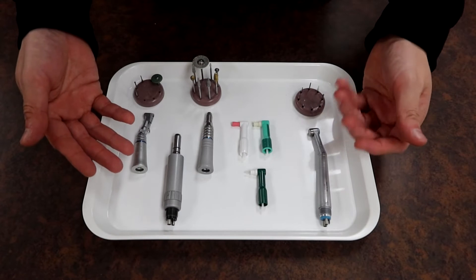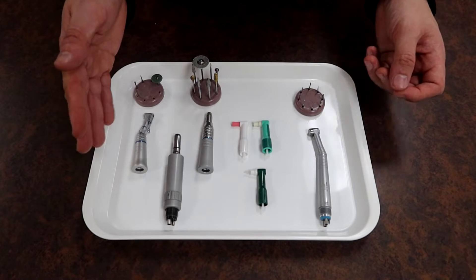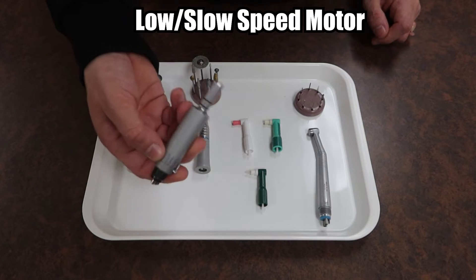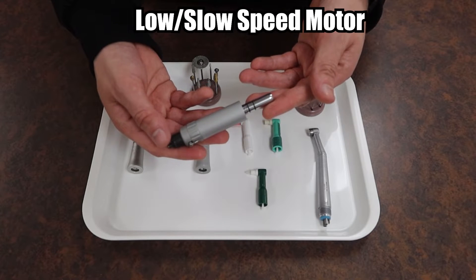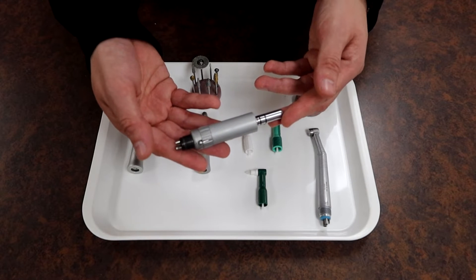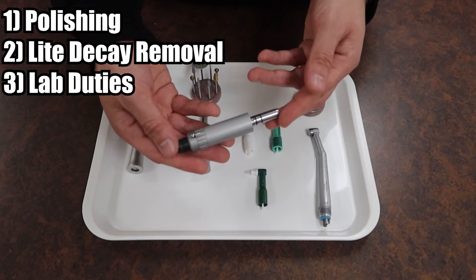For the handpieces we have here, we have a neat selection starting with what we're going to talk about first — our slow speed and its attachments. Starting with our slow speed motor, this whole long piece is going to be the driving train of our handpieces. Not the high speed one that cuts and takes apart your tooth, but the slower one responsible for polishing, light decay removal, and laboratory duties.